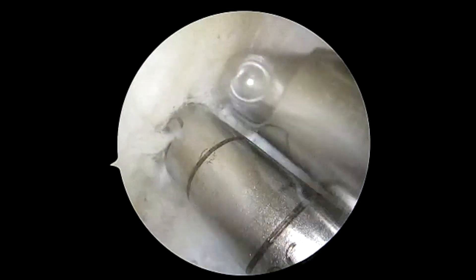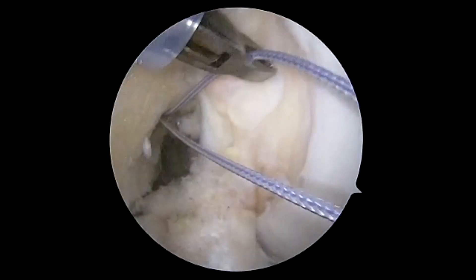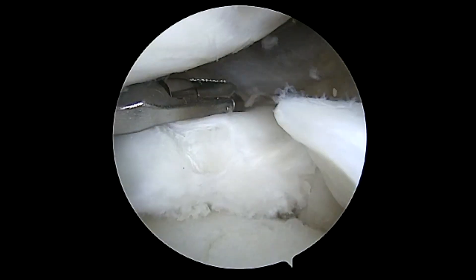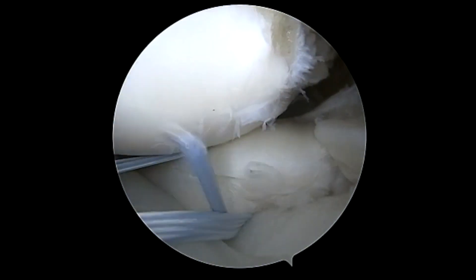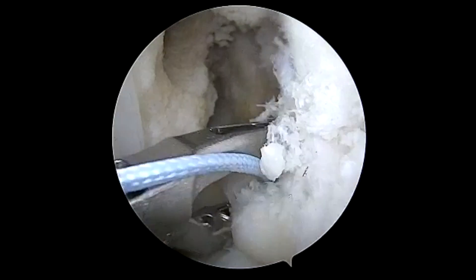Before completing any passes, we'll drill our femoral tunnel, usually to a depth of roughly 20 to 25 millimeters. You can see we're passing outside of the passport cannula to avoid damage or suture tangling. We use our passing device to pass a tape suture through the meniscus on one side.